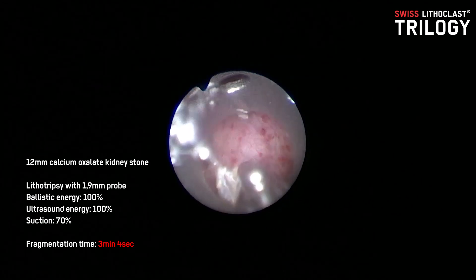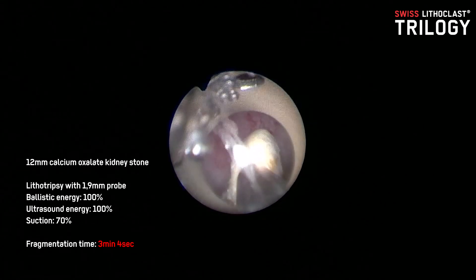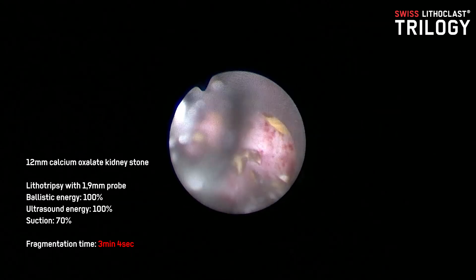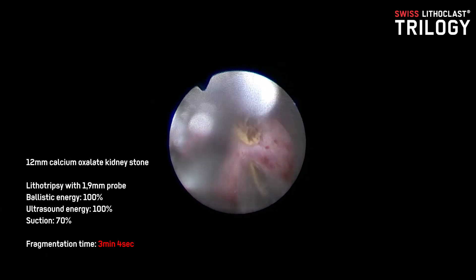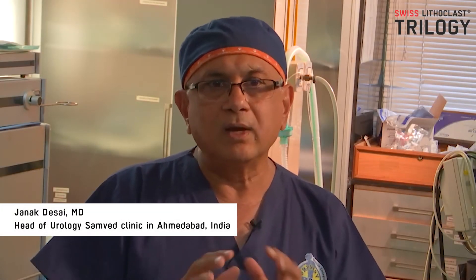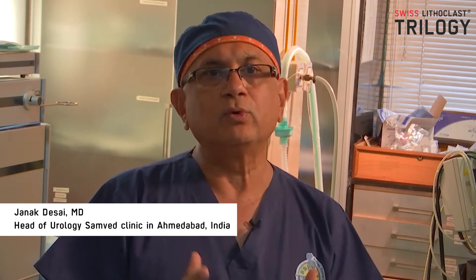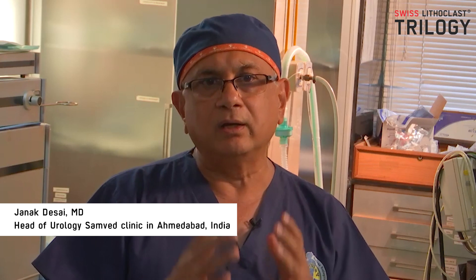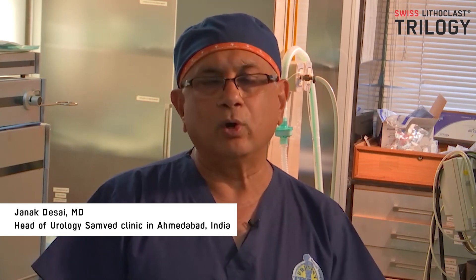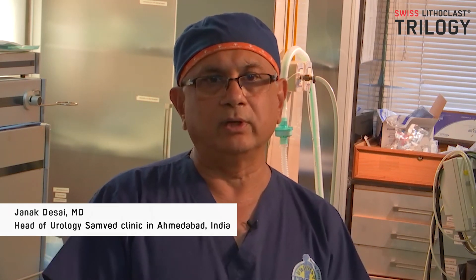It can break stones into fine small fragments which can be pulled away, so stone-free rates are going to be better. As you operate, the suction also removes that little bit of bleeding which would otherwise mar your vision, allowing you to have a very clean operative field. It allows you to break the stone and pull all the fragments out, so all aspects of stone management are managed by this single unit.